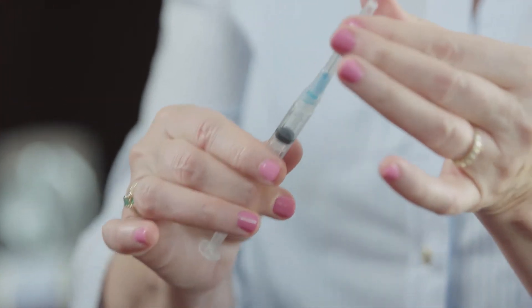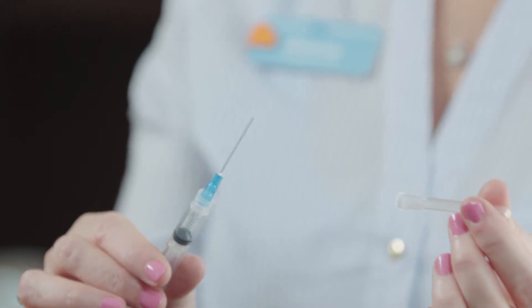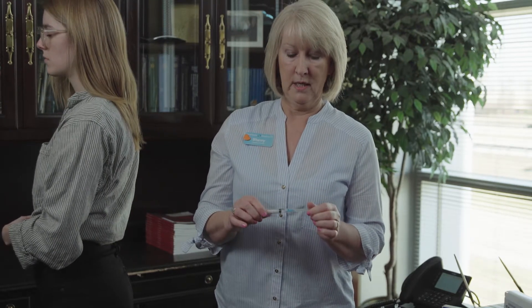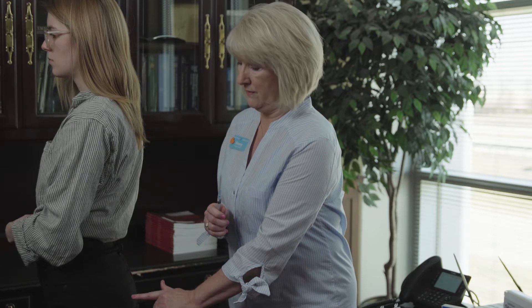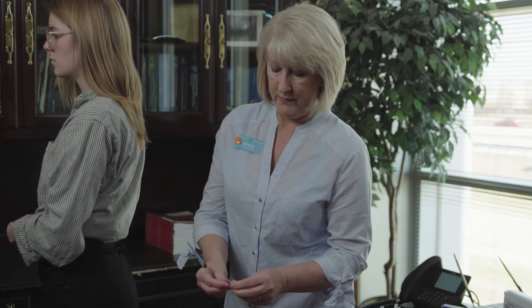It's still an inch and a half long to get to the muscle, but it is much thinner than the mixing needle. Now you are ready for your injection. Once your medication is mixed and the injecting needle is on, you will likely need someone other than yourself to administer the injection. The injection site is the upper outer buttock. You do not want to go in too far or down too far on the buttock.